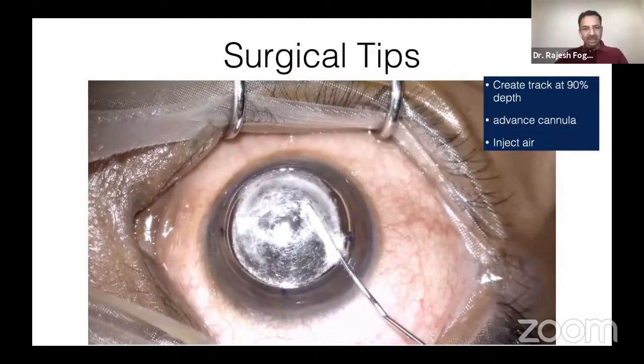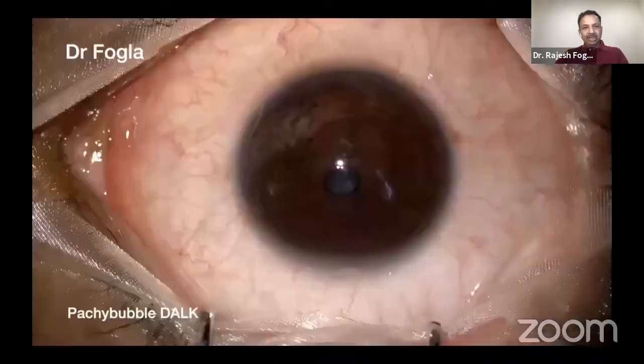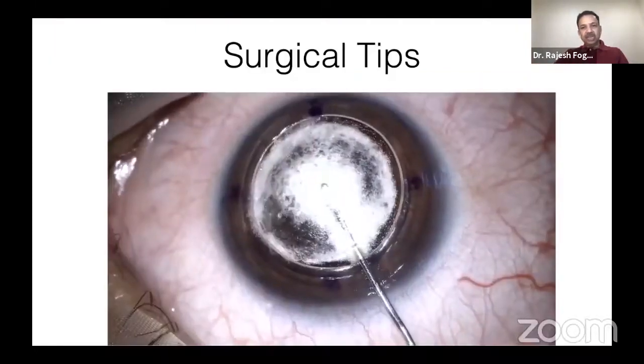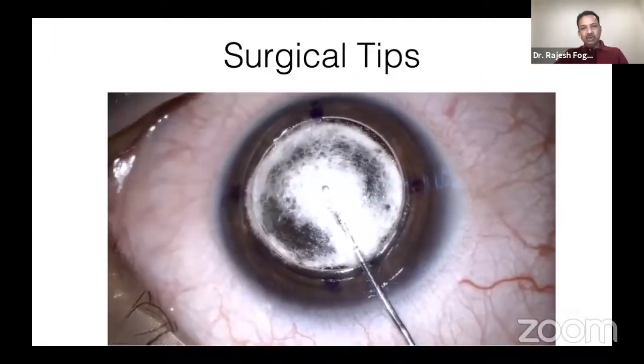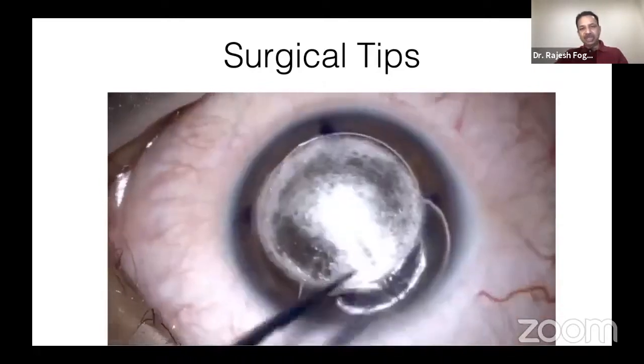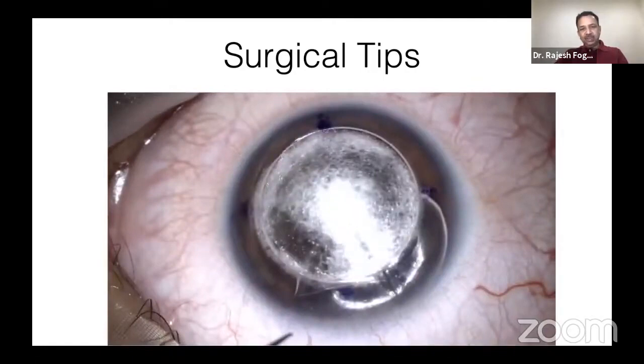You continue injecting air. Let me show this video first. When you're injecting air and you're going outwards, you will feel an increasing resistance. That is because the aqueous has nowhere to get displaced. And if you feel resistance and you persist with enlarging the bubble, often you can end up perforating the anterior chamber, because the counter pressure from the aqueous has been quite a bit.